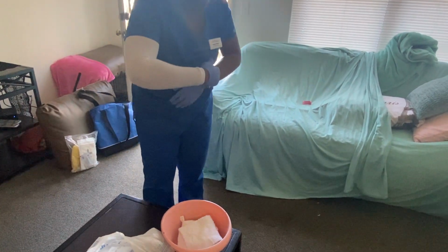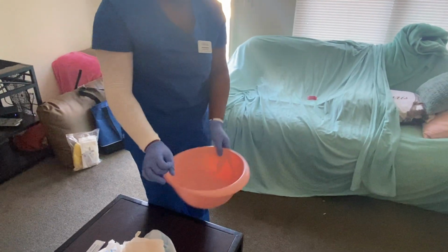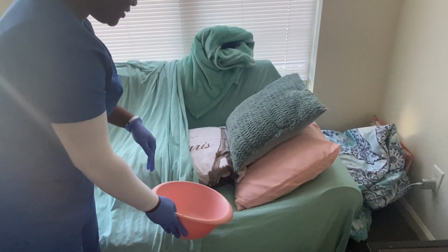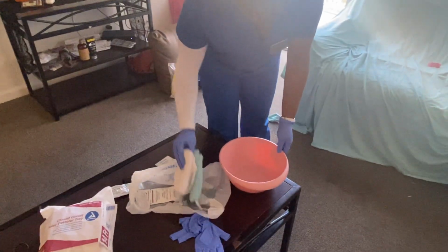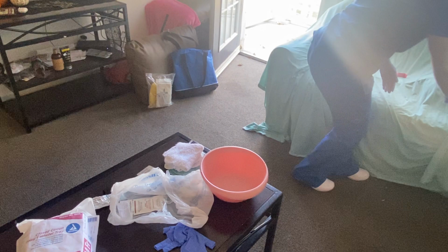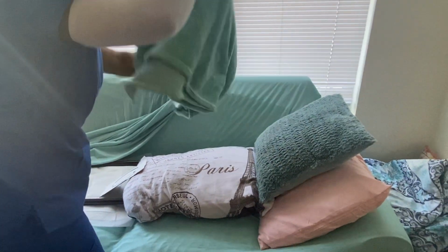So, I have some water here. Miss Bernadette, do you mind feeling the water to see if it's too hot or too cold? It feels just fine. Okay, thanks. That's great. Okay, so now I will be washing your perineum. So let me pull the cover back a little bit, and I'm going to expose your bottom half. Let me cover your top half.